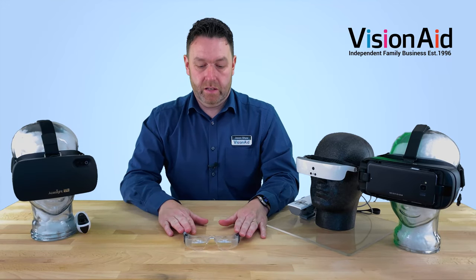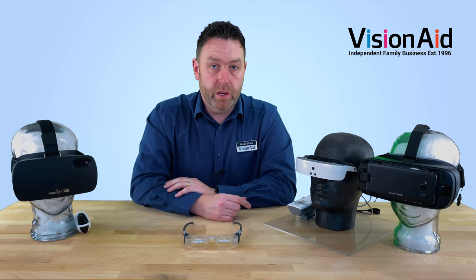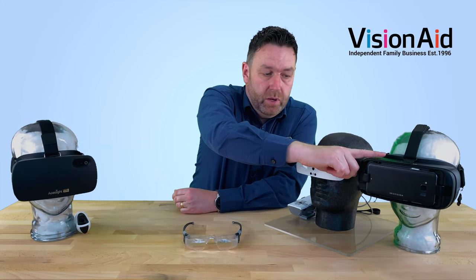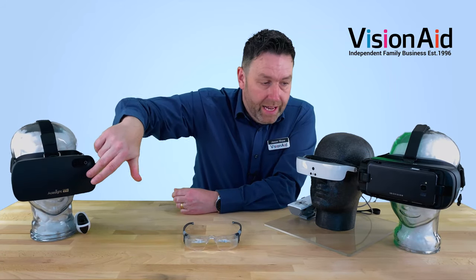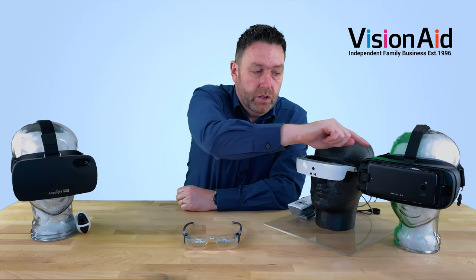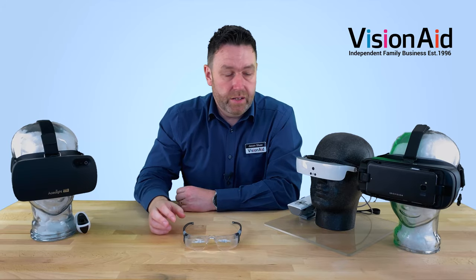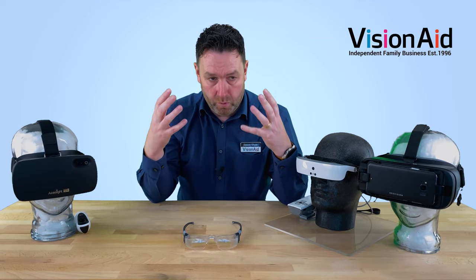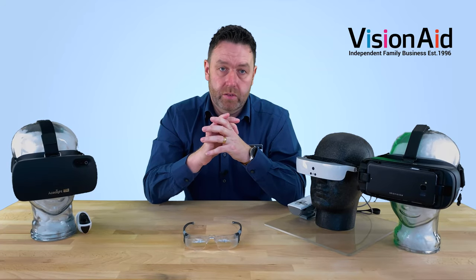Moving on from the Max TV low-tech solution, we're going to now look at the high-tech solutions. Here's just a small selection of what we offer: we've got the new Acesight and we've got the Iris Vision. Both these use virtual reality headsets with a mobile phone in the front of the headset. The camera looks around and sees what you need to see, and you look through the headset at the screen on the phone — a really high-quality, high-definition camera and screen. You can see things in full colour, get a nice wide field of vision, and you also get the ability to zoom in and zoom out.